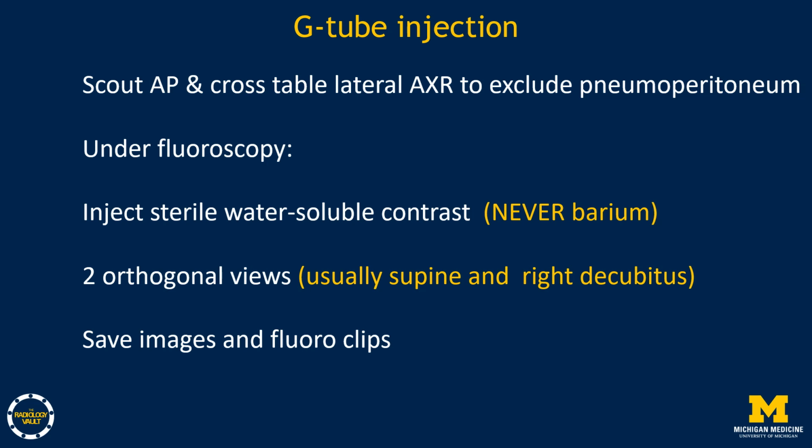Under fluoroscopy, inject sterile water-soluble contrast, never barium. At Michigan Medicine, we use Isoview 250 or Omnipaque 240. We don't use gastrographin because it's hypertonic and may cause fluid shifts, particularly in small patients.